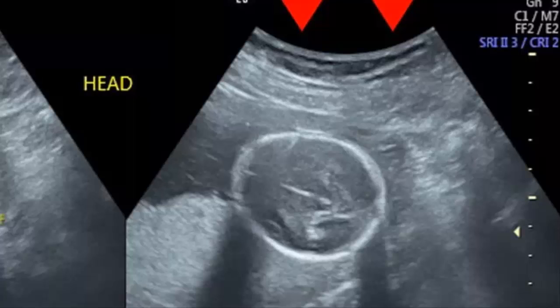2. Start from the top of the image. The top of the screen or printed image is where the ultrasound probe was placed. In other words, the image you see shows what the organ or tissues look like from the side rather than from the top. For example, if you are having an ultrasound of your uterus, then what you see at the top of the screen or printed ultrasound would be the outline of the tissues above your uterus. As you look further down the screen, you will see deeper tissues, such as the lining of your uterus, the inside of your uterus, and the back of your uterus.